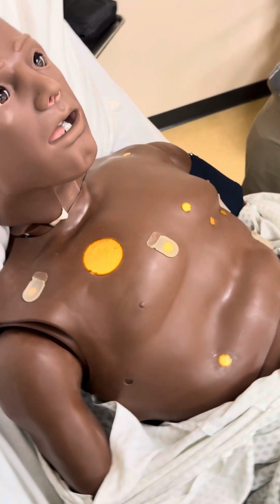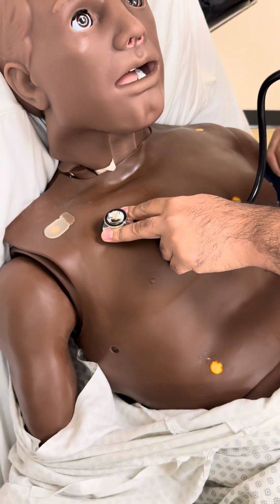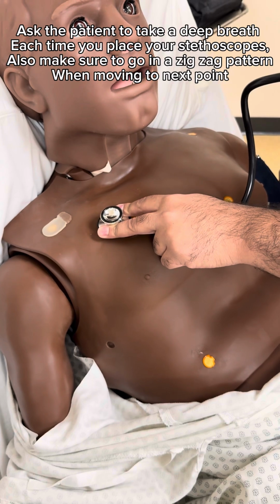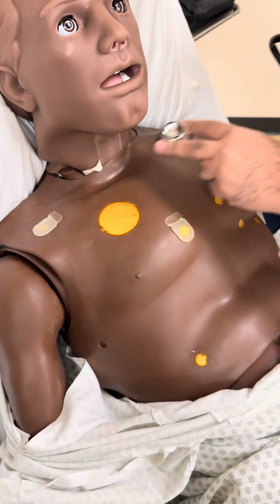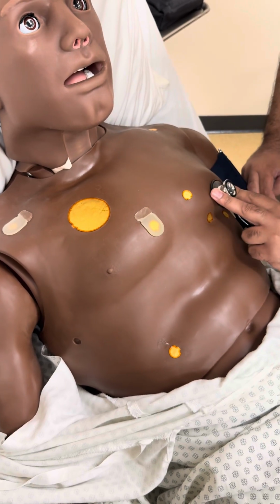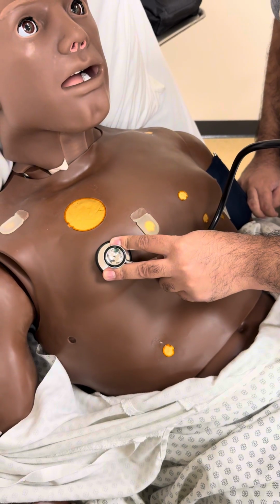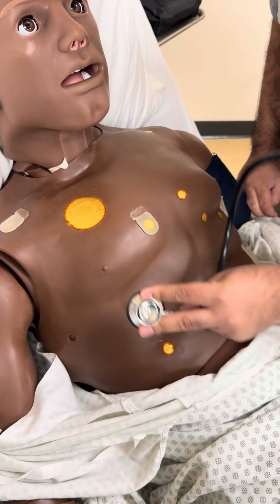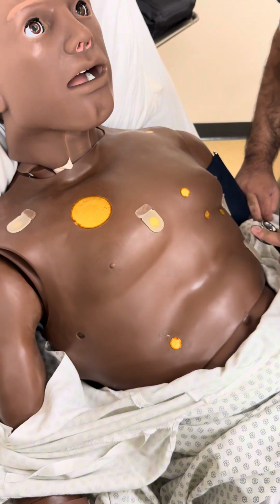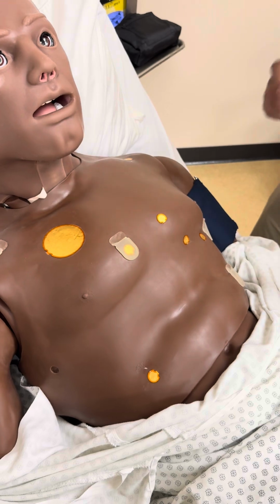Okay, once the chest has been exposed, we will start on one side, at the top of the lungs, listen for one full breath and ask them to take a deep breath. That would be one full breath. Now I'll move to the right. Deep breath for me. Go down, deep breath. When you get to the bottom, you want to go a little bit to the side to get the base. One full breath. Other side, and one full breath. So that'll be the 6 points in the front.